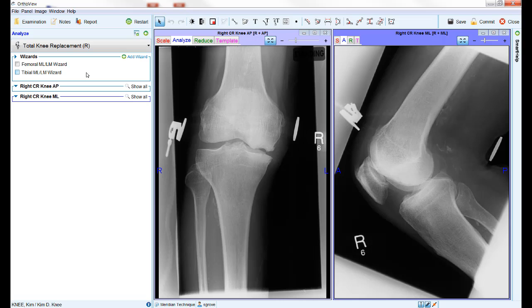On the left hand side of the screen you will see a number of tools or wizards. These are the specific wizards designed to help with planning a total knee arthroplasty. The purpose of these wizards is to allow the user to mark and measure key points on the patient's anatomy. The software can then use this information to do some initial sizing and positioning of the implants, as well as provide useful metrics such as valgus varus angle.